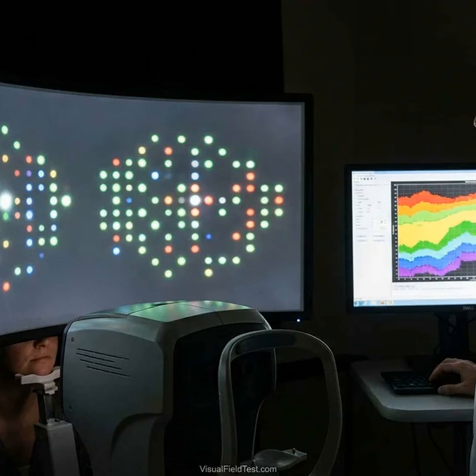However, macular vessel density in the inner retina seems less predictive than macular thickness. One large study found GCIPL thickness outperformed macular OCTA vessel density for separating glaucoma eyes from normals. Clinicians can combine these findings. Focal field losses on specific color perimetry often correspond to focal thinning or perfusion drop on imaging. For example, an inferior arcuate defect on SWAP usually matches superior RNFL thinning on OCT. OCTA can add further detail. Areas of capillary dropout often align with the most damaged sectors of the nerve. Overall, targeted perimetry abnormalities flag regions to scrutinize on OCT.